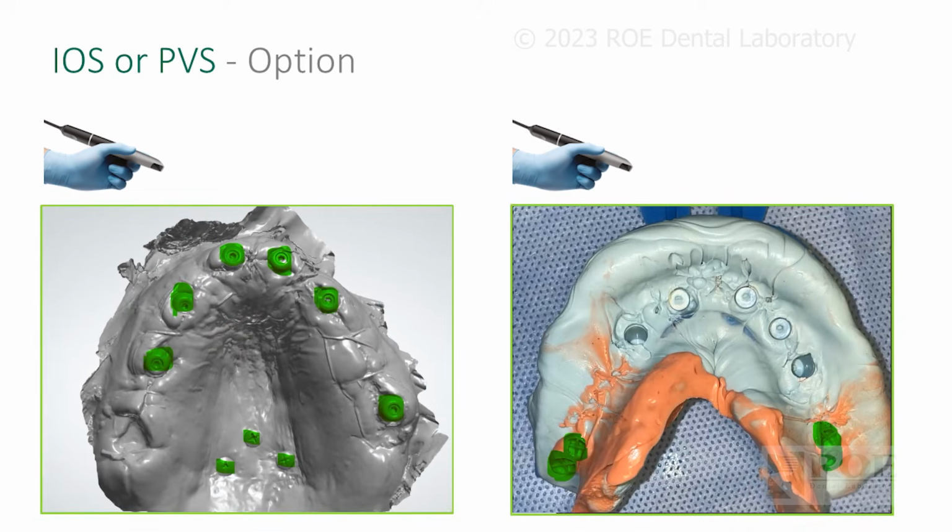Right. So then you perform the next scan, which is healing collars and the fiducial markers. If you have a tough time scanning this, because some scanners really struggle with moving blood, moving sutures, lots of tissue area, like I would not use the iTero, for instance. I would definitely just make sure you practiced if you use the iTero. Some other scanners will not work. We'll give you a list shortly. It's in the program, but you'll struggle with that if you don't use the right scanner.